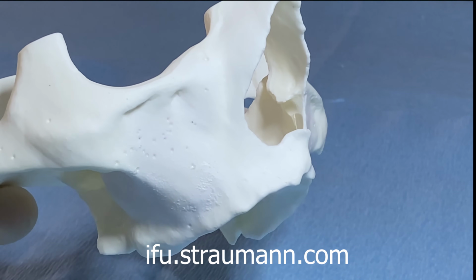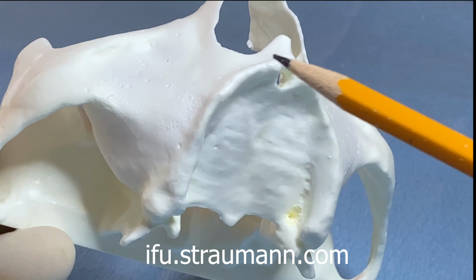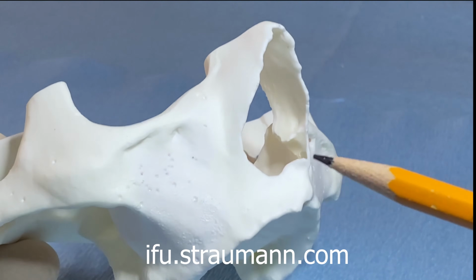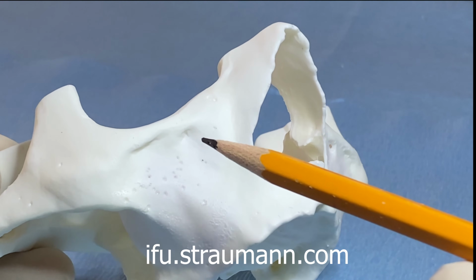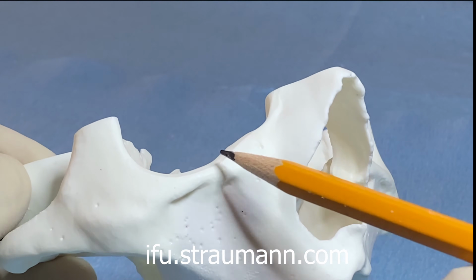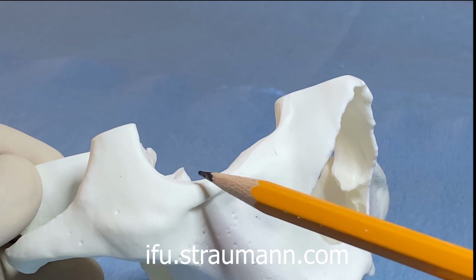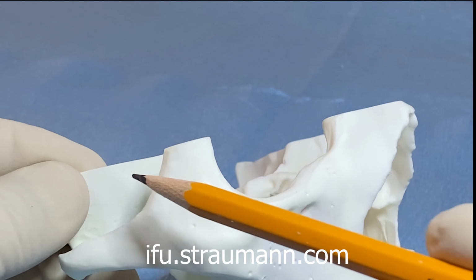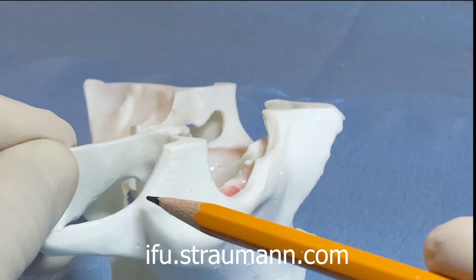To review the anatomy, once the flap is made, we look at the crest of the alveolar bone. We look at the lateral nasal aperture. We look at the infraorbital nerve. We look at the infraorbital rim, especially the lateral portion here if a quad zygoma is considered. The frontozygomatic notch, right here where the retractor sits.